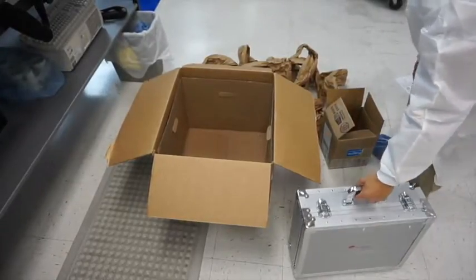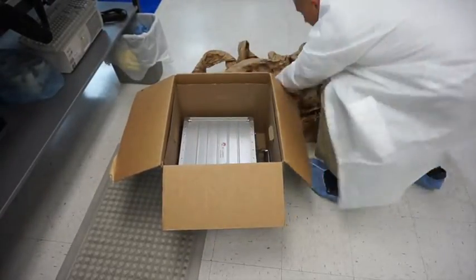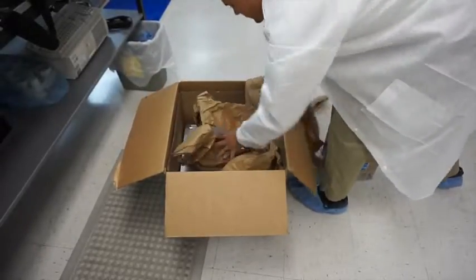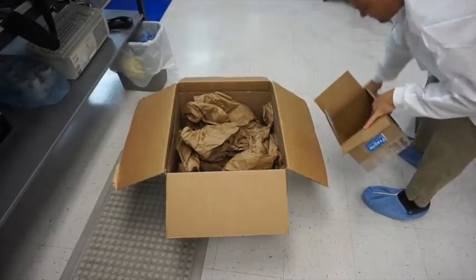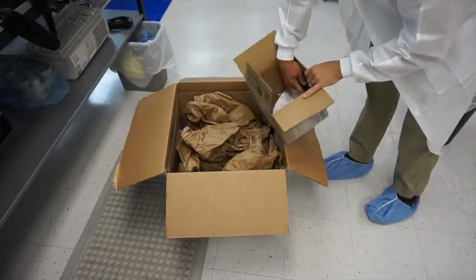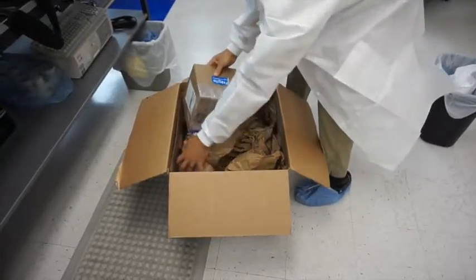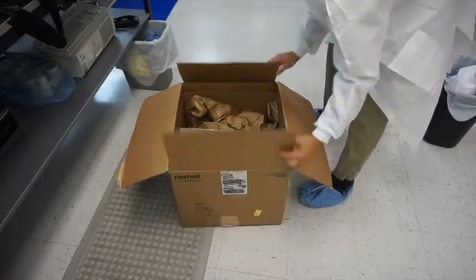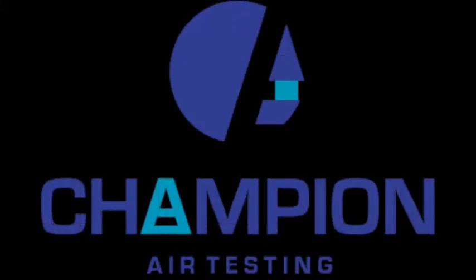You can use the same box that the air sampler came in to ship back to the micro lab. Make sure that the case inside is secured properly. There are two ways of shipping it back — the air sampler itself can either go ground or overnight. With the air samples, it's important to get your air sample plates overnighted, as that reduces the chance of cross-contamination, damage in shipping, or prolonging the incubation period. I hope this video was helpful and don't forget, if you have any questions feel free to call us at any time.